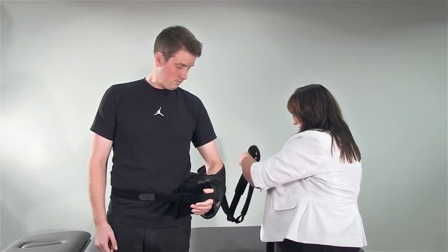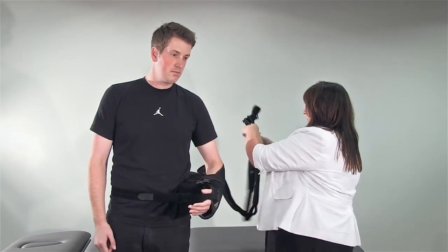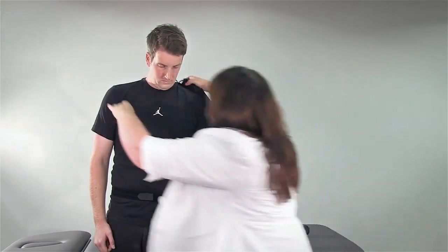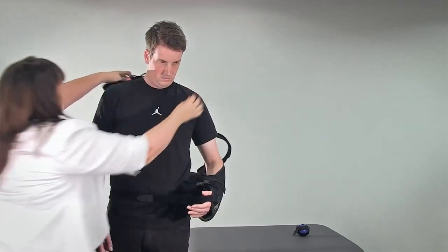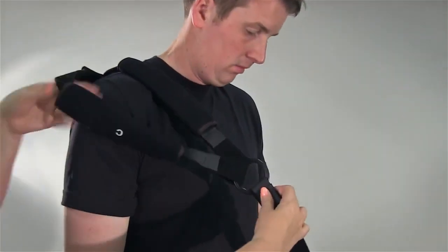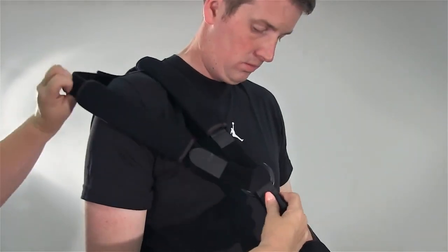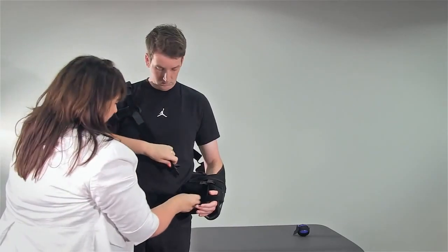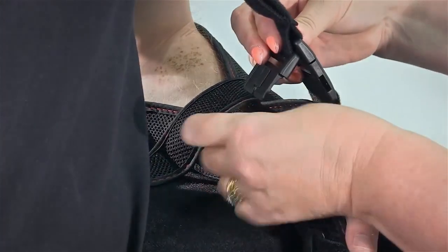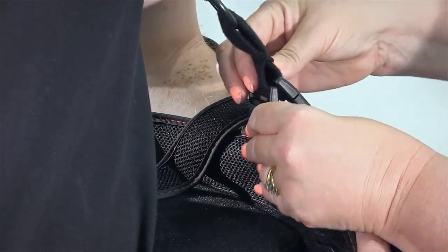Take hold of the shoulder strap, treating the double strapping in the middle as one strap, and place it around and over the patient's shoulder. Clip the two buckles onto the sling and adjust the Velcro on the strapping to ensure the sling fits securely and comfortably.